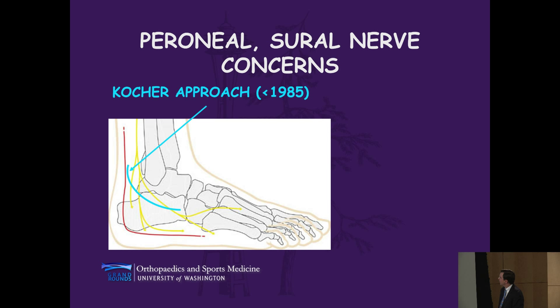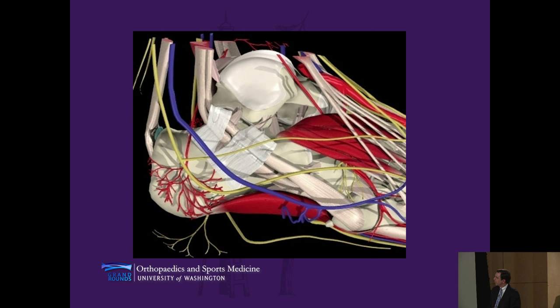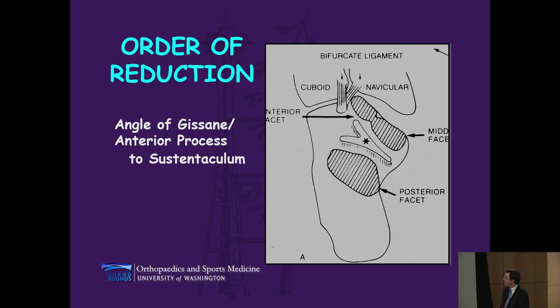And unfortunately, we had the discouraging view of a number of structures we didn't really want to see, the sural nerve and the peroneal tendons, many of which would granulate in at the time of closure of the wounds because the soft tissue envelope was very precarious in this area. So we evolved to this more extensile approach where you are doing a J or an L, with a periosteocutaneous elevation of all of the structures on the lateral side, including the peroneal tendon sheath.